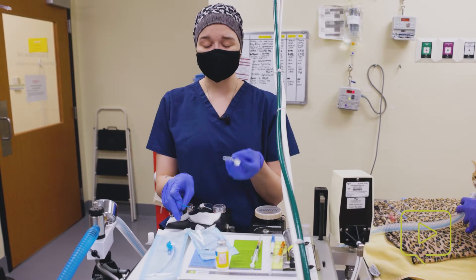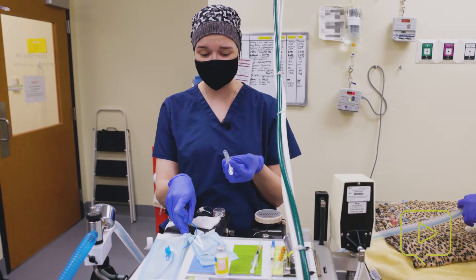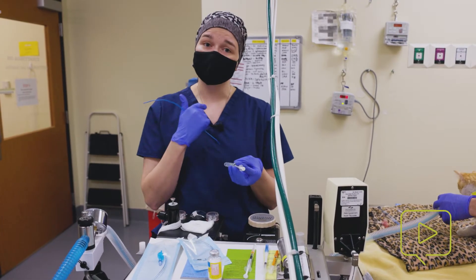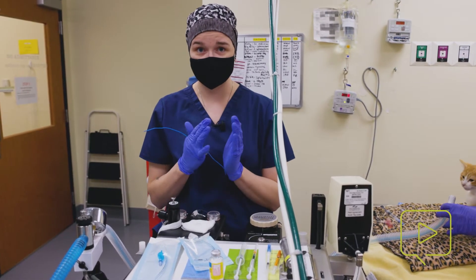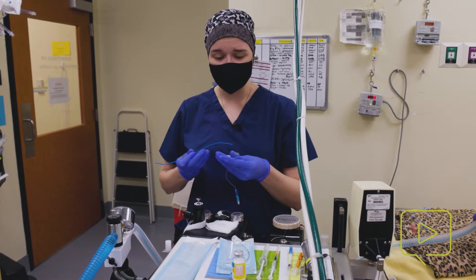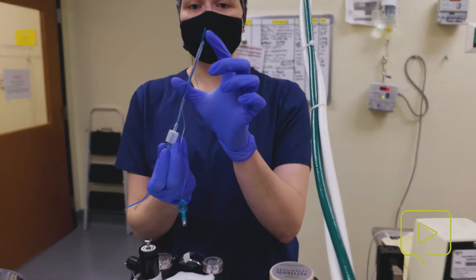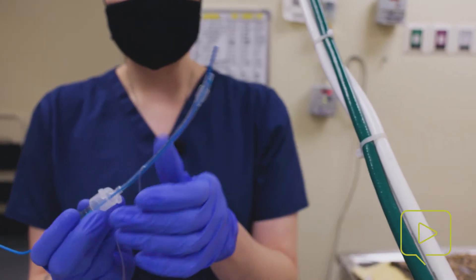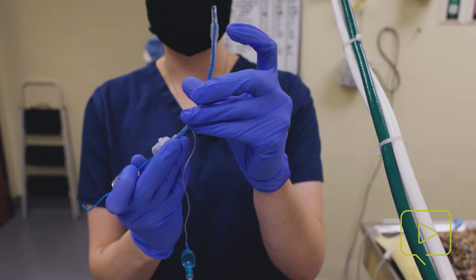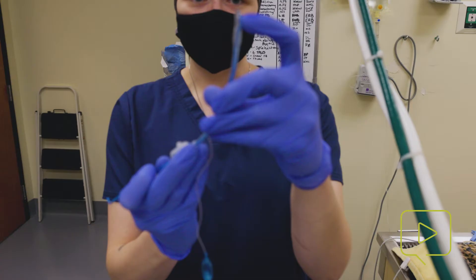We're also going to use a little bit of lidocaine — this is injectable lidocaine. About 0.1 to 0.2 mils is sufficient. We just put this topically toward the larynx on those folds and it helps minimize some of those spasms. A note on stylet placement: you do not want the stylet to pass beyond the end of the ET tube, as this can cause damage to the trachea. You only need the stylet to come to about a centimeter away from the tip. You don't want to cover this hole — you want to leave that open.